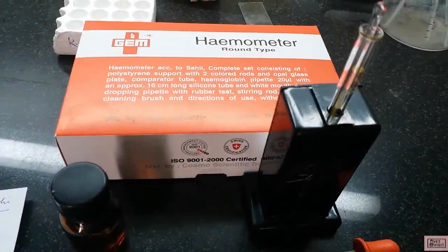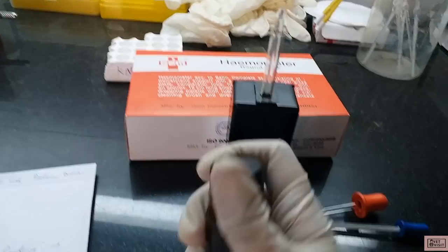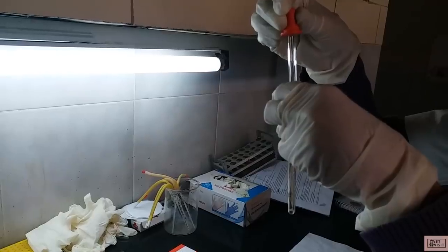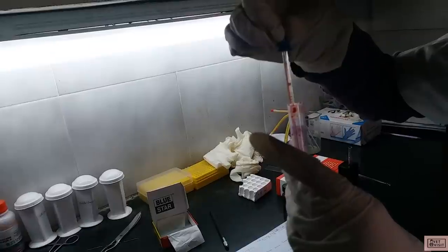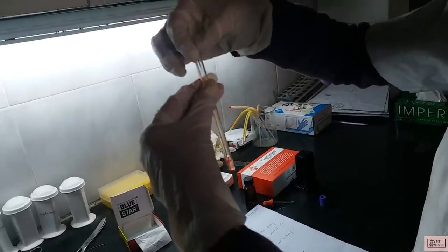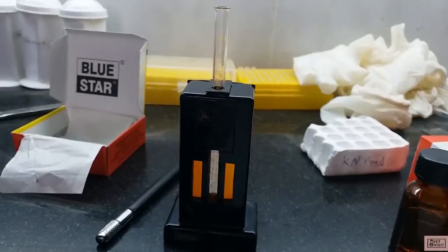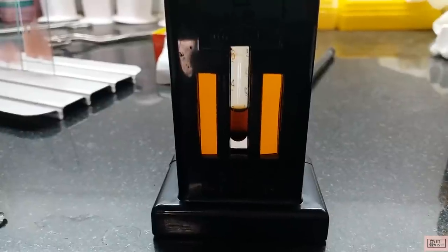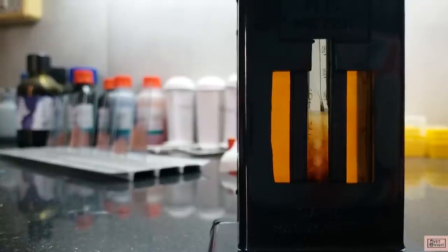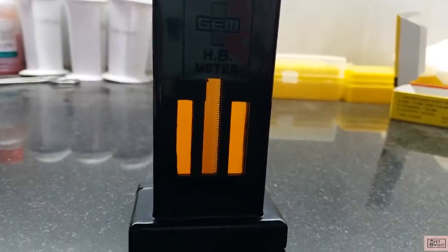The next test for the day was estimation of hemoglobin level using a hemometer. First we have to take 0.1 normal hydrochloric acid up to mark 2 of this tube. Then we withdraw the blood sample up to mark 20, transfer it into the tube containing 0.1 normal HCl, and mix it well. Let it stay for around 10 minutes so hemoglobin gets converted to acid hematin, which is brown in color. To get the reading, we dilute this solution with distilled water drop by drop and stir it continuously until the color matches with the brown color comparator tubes.